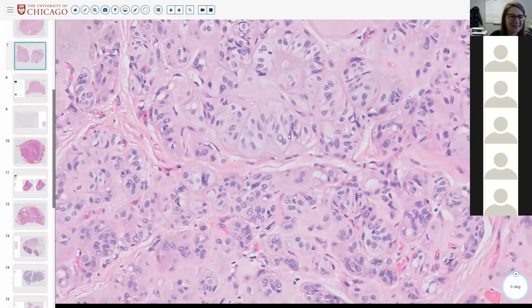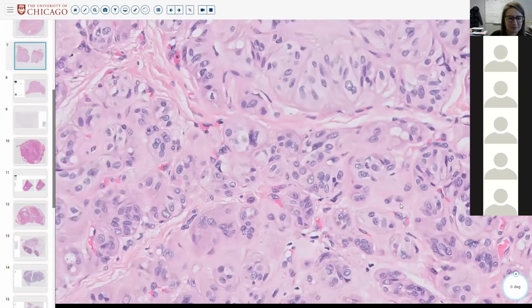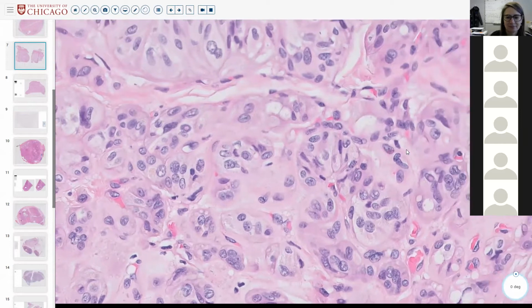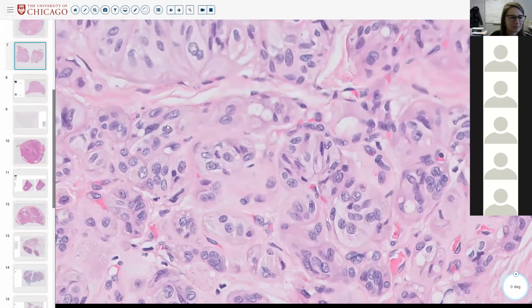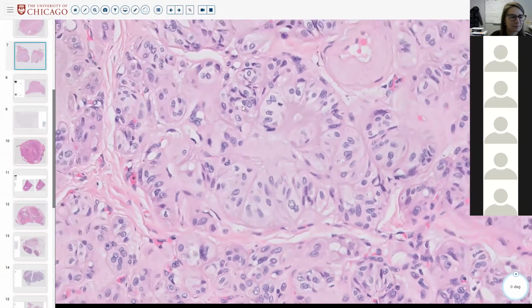So some of them have a little bit of grooving. Now I see one or two have inclusions, yeah, these I see pseudo-inclusions.